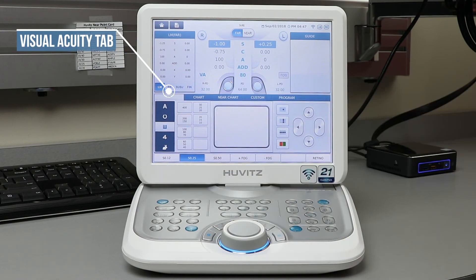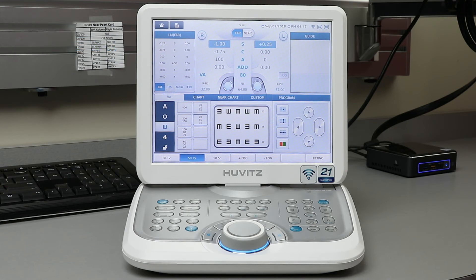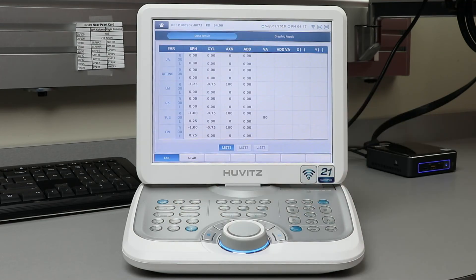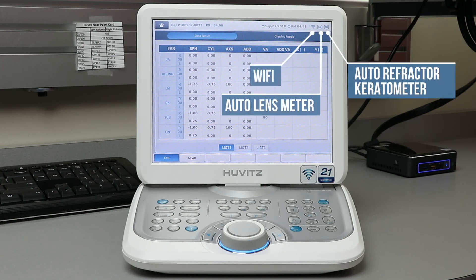Select the VA tab to go back to your main menu. When you have finished your refraction, press the Finish button. Press the Print button to pull up a readout of your examination. Press Print again to send this information to your EMR system via our HDR Mate software. In the top right corner, you will see the icons for Wi-Fi, Auto Lens Meter, and Auto Refractor Keratometer, showing that these are all connected.